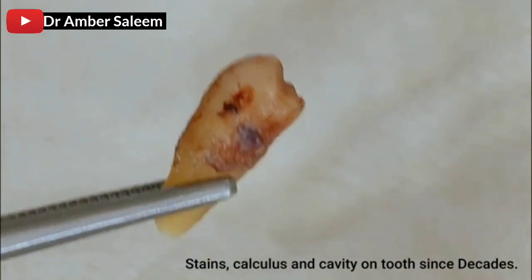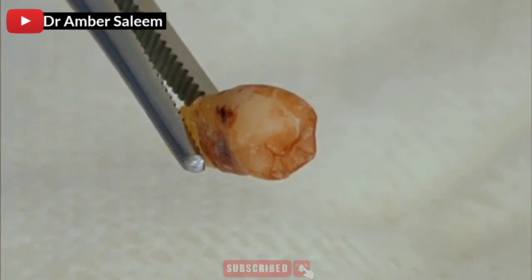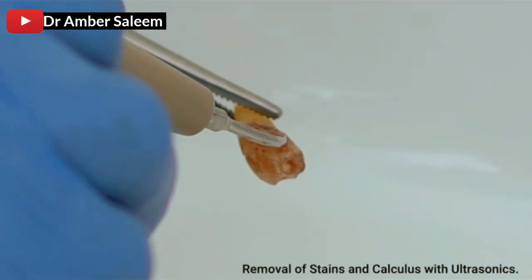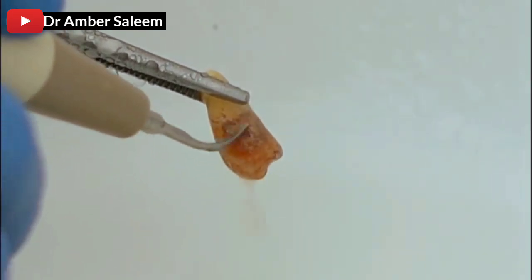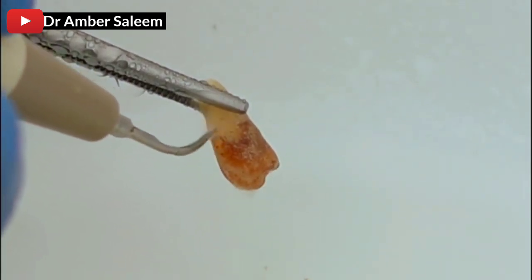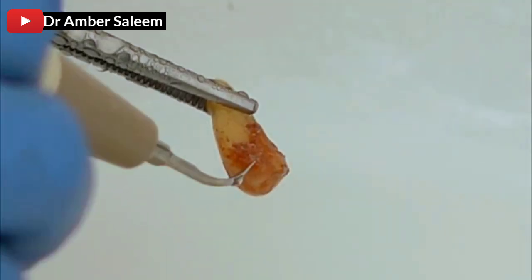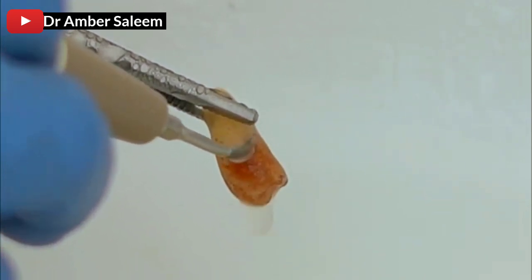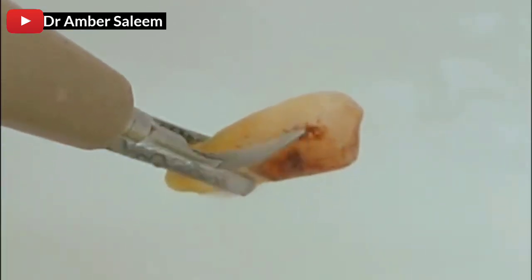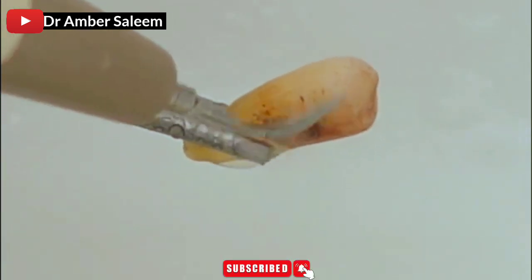Stains, calculus and cavity on tooth since decades. Removal of stains and calculus with ultrasonics.